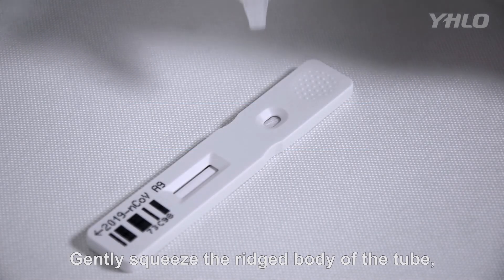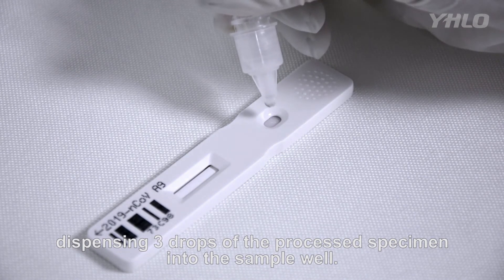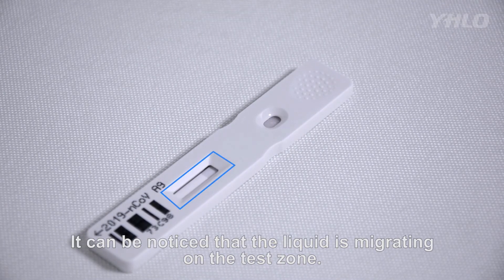Gently squeeze the body of the tube, dispensing three drops of the processed specimen into the sample well. It can be noticed that the liquid is migrating on the test zone.